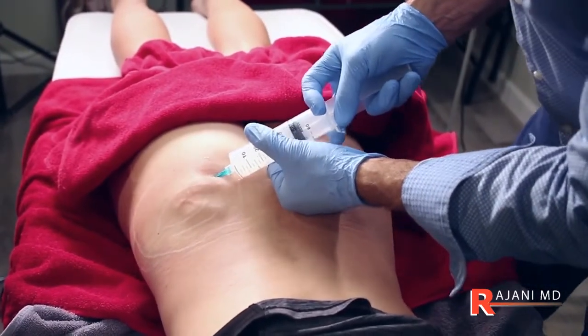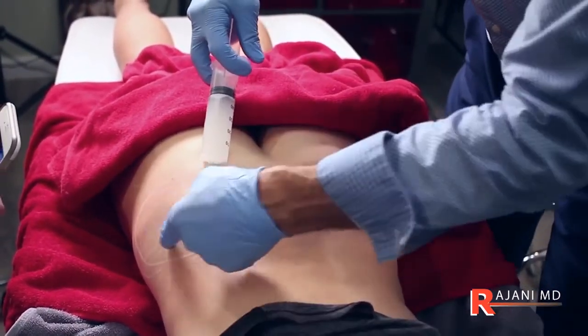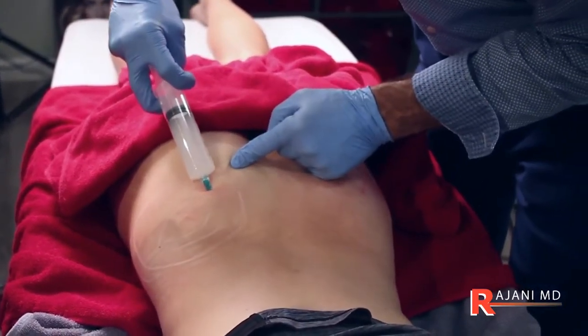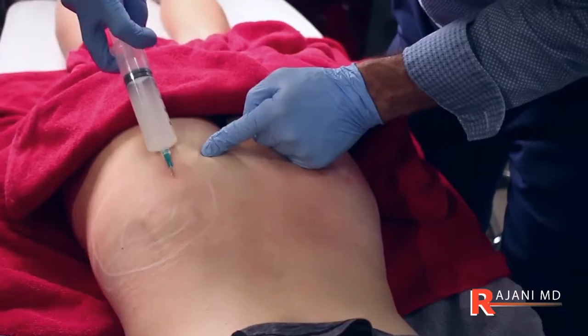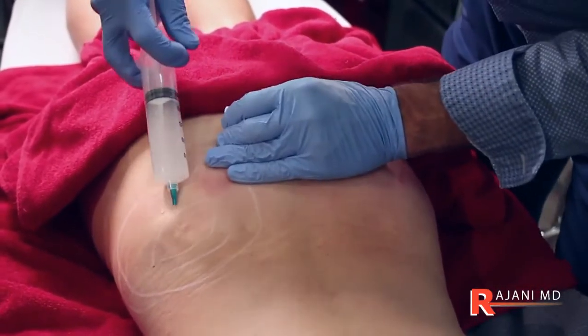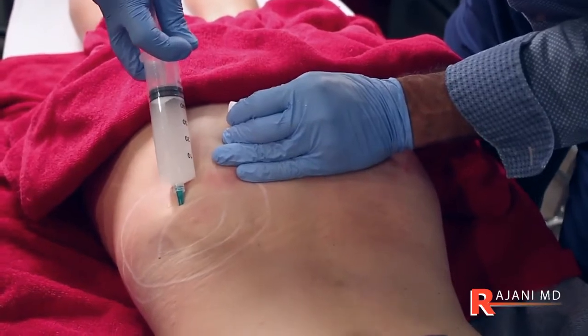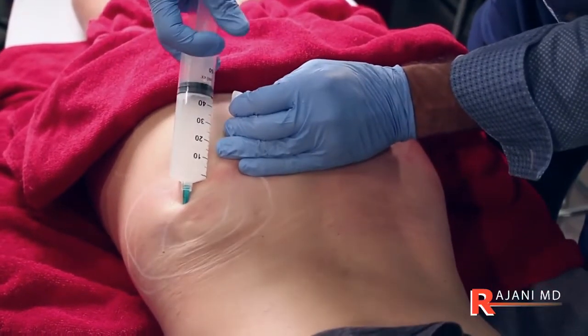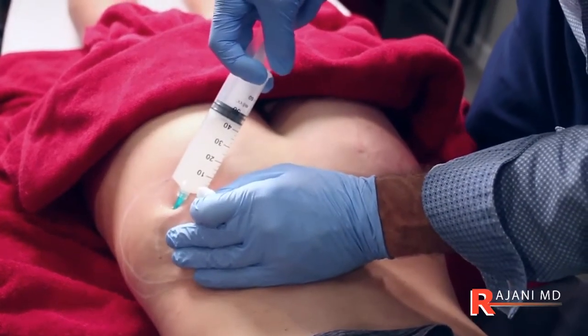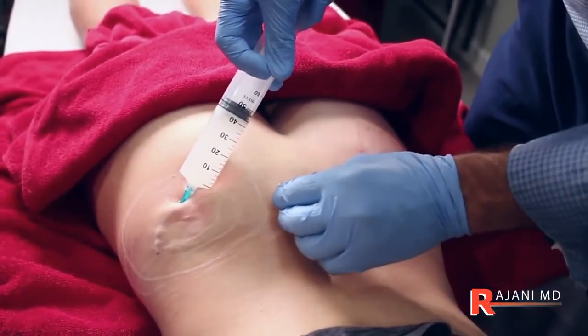I put a concentric ring where I ask the patient where we want the most volume, and then I fill around that. There's a hard push here because it's a big syringe. You can already see increased volume. You don't want to be superficial. It's not intradermal. We're in the fat layers. And if we stay high, we're going to get a nice lift.